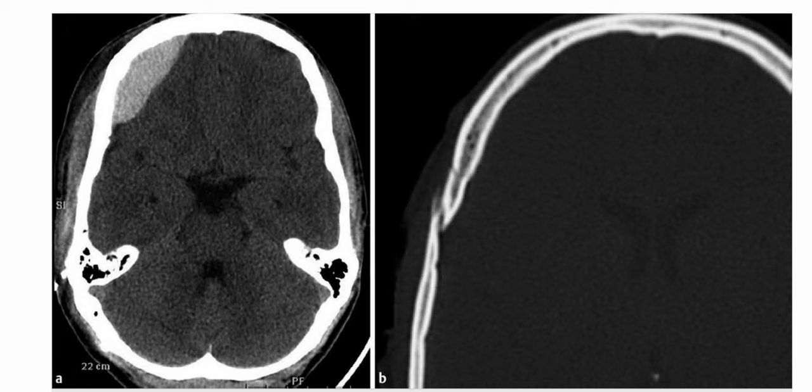And this is the cone down, that is the zoomed in axial CT scan image in bone window, and it reveals a non-displaced fracture of the frontal bone, which is just anterior to the coronal suture with mild sutural diastasis. And overlying scalp skin laceration is also noted with the soft tissue swelling. So this is a case of epidural hematoma. It's quite evident, and this is the only diagnosis here.